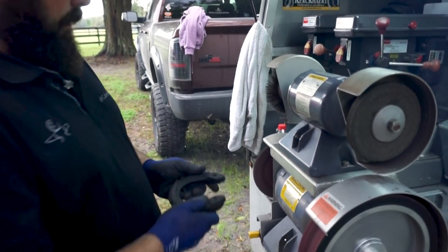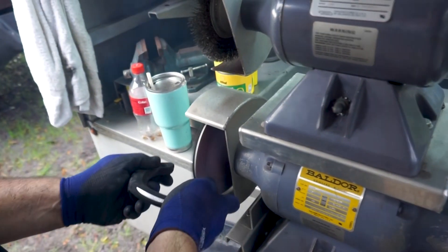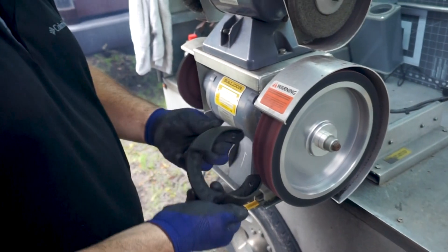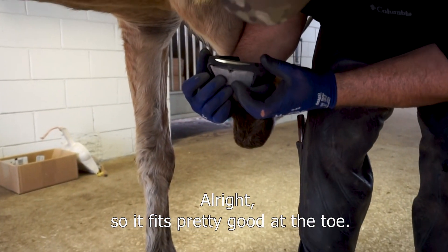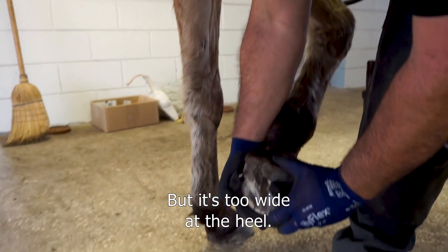Now we're going to do a heel check — we're going to round it. It fits pretty good at the toe, but it's too wide at the heel.